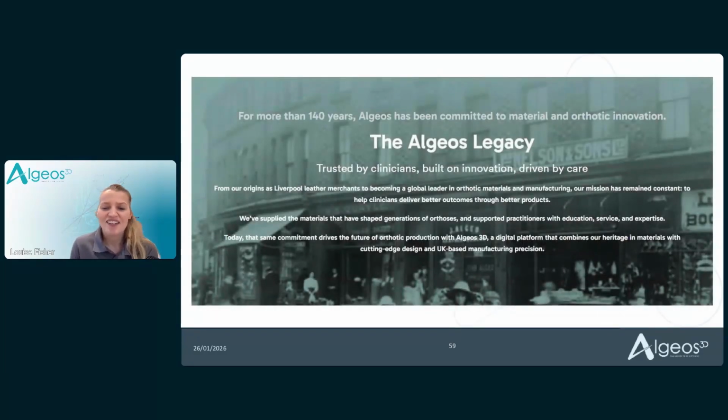I'll leave it on this last slide, really just to consolidate where we are with Algeos 3D, and I hope that you've enjoyed the experience and what I've talked through today. It really is built on Algeos's legacy, which has been over 140 years where we have been committed to materials and orthotic innovations. Algeos 3D is a blend of all of that.